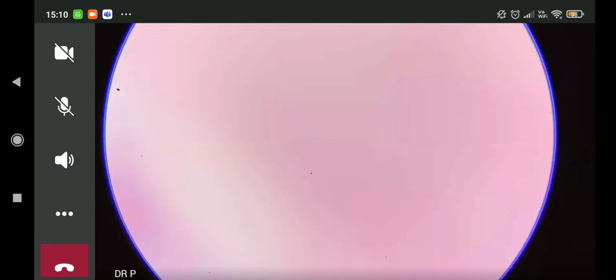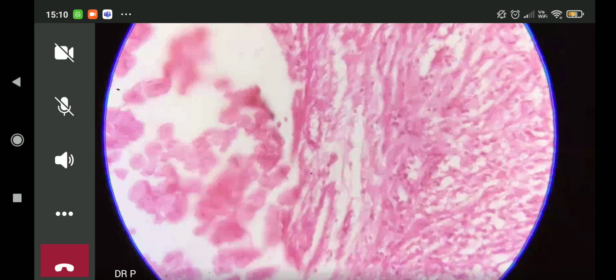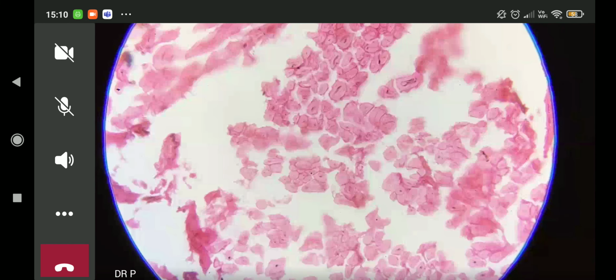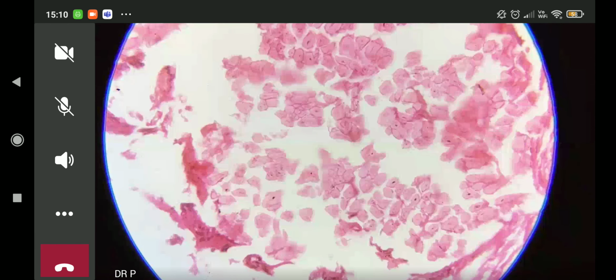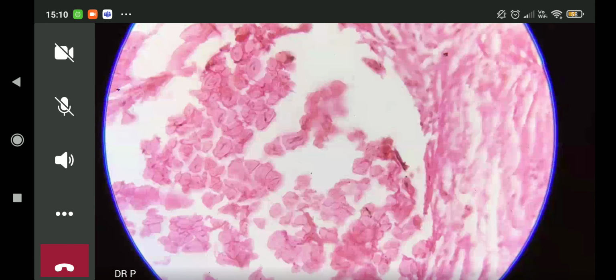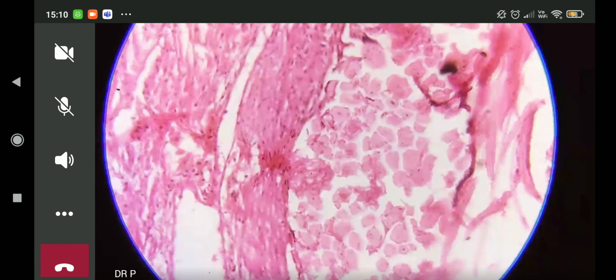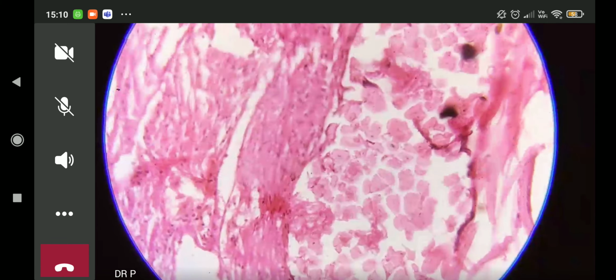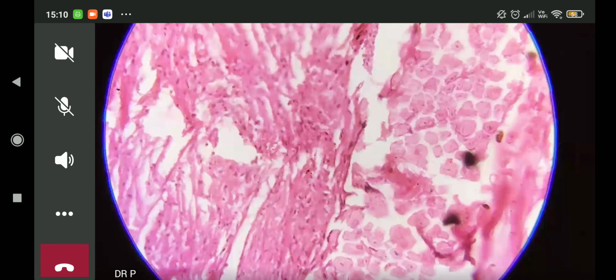So over here, look at this. What's inside the granuloma? Something inert, something that is not biological. It's not something that we've studied in normal histology in year one. It's something different. And this, children, is nothing but a foreign body. A foreign body means anything that is foreign or alien to the human body, which is coming from the outside world.